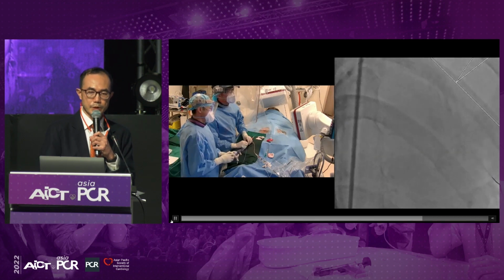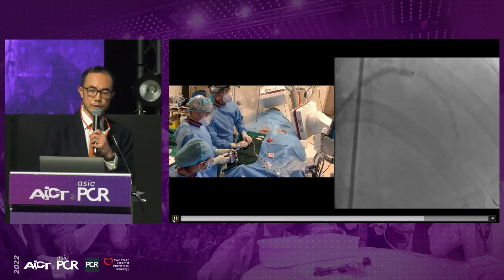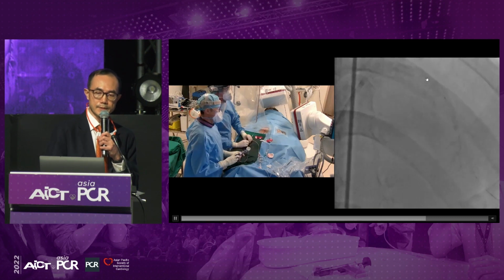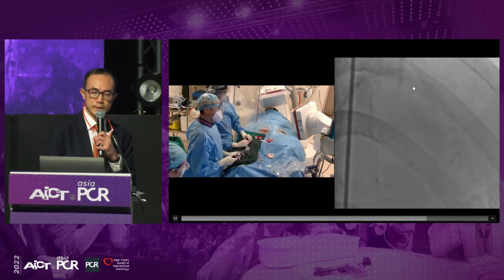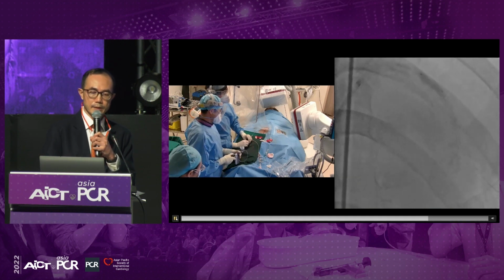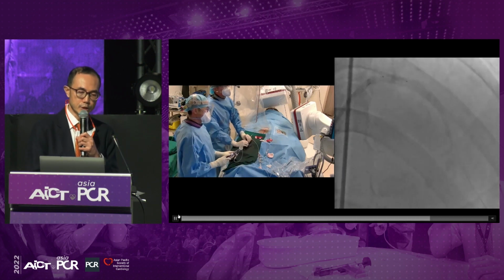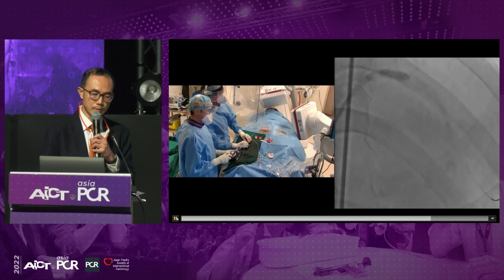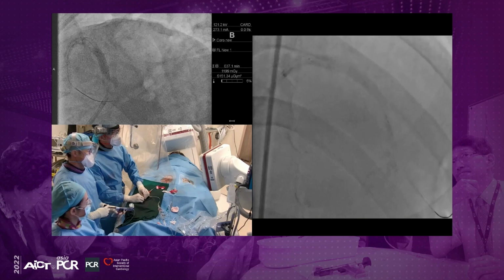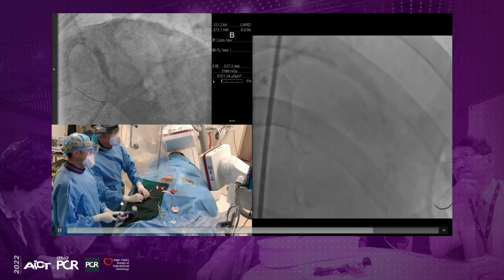It's actually quite radio-opaque, so placing the stent was quite straightforward, and we aligned it with minimal stent overlap with the distal stent. So again, you saw how easily the stent was expanded. Following the stent deployment, we proceeded to post-dilatation, as is usually required, using a 3.5 millimeter balloon distally, as well as a 5 millimeter balloon proximally.